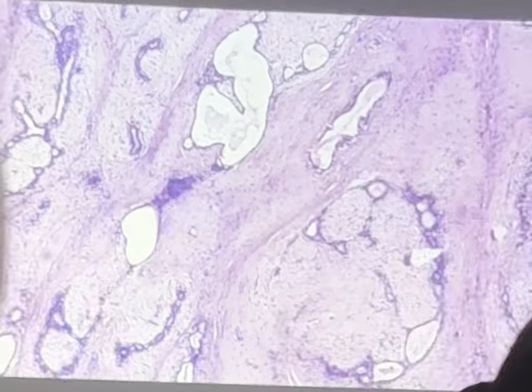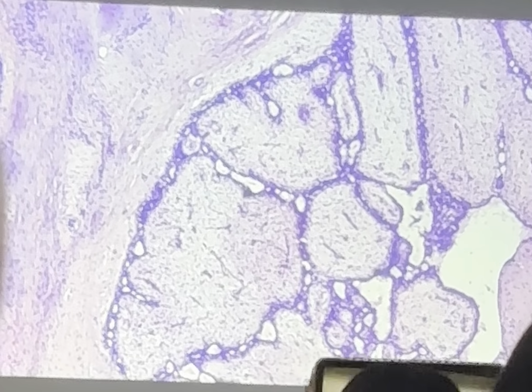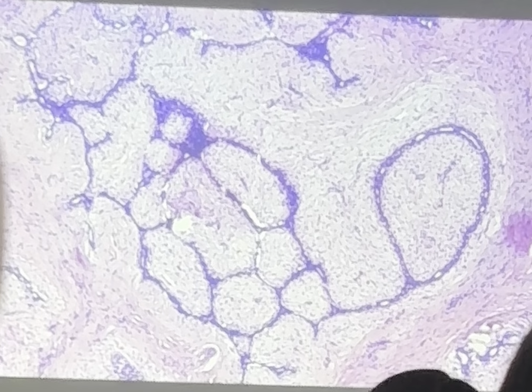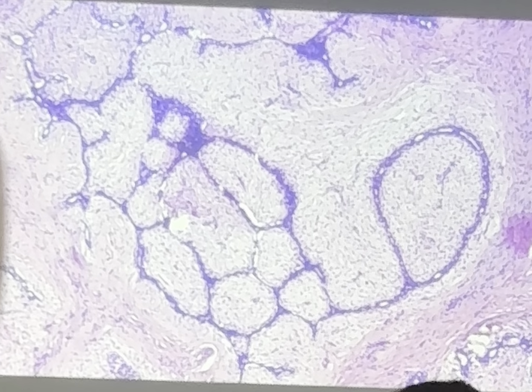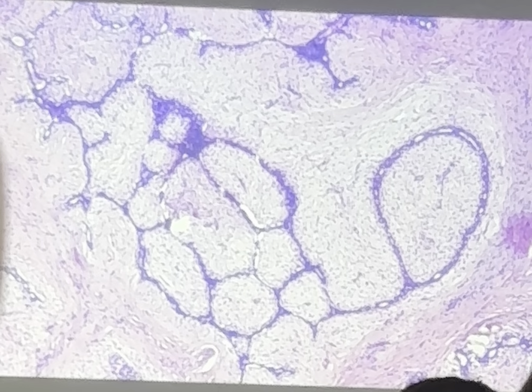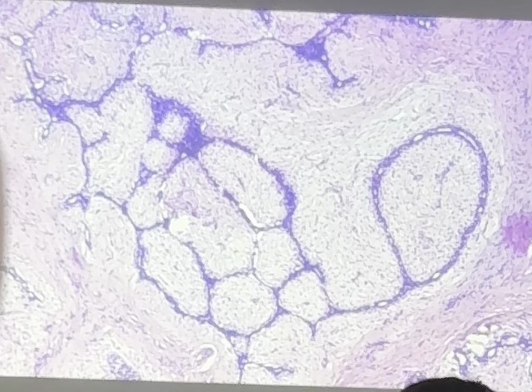And then we see this. Okay. Do you think this is benign or malignant? It's actually benign. Yeah, relatively. Smoother borders generally favor benign neoplasm because malignant ones infiltrate irregularly. This one's benign. So what's actually happened here?